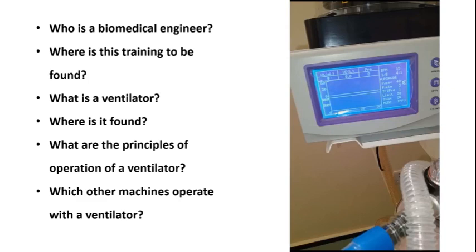What is a ventilator? A ventilator is a machine that mimics human breathing. If you visit a hospital facility or a medical facility, clinic, you may come across a ventilator.